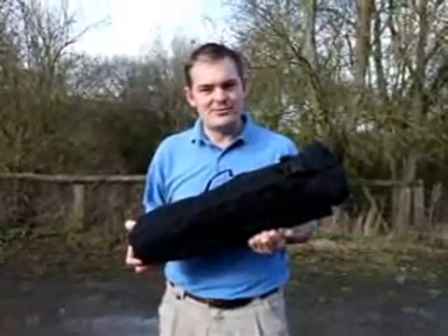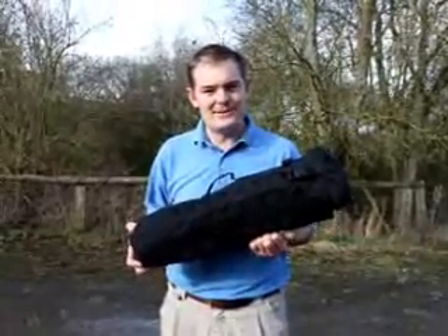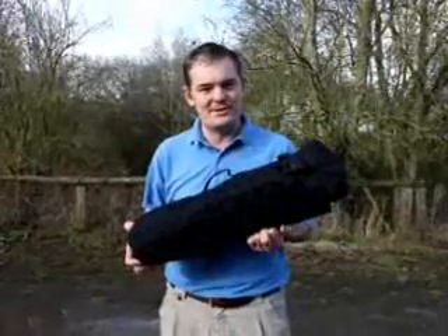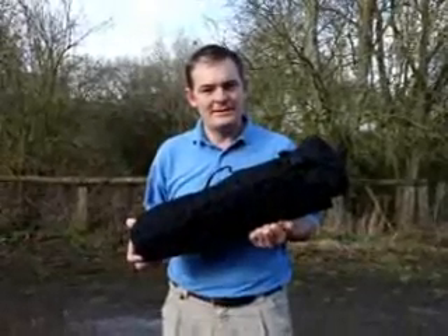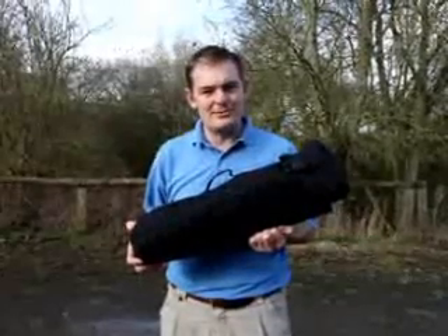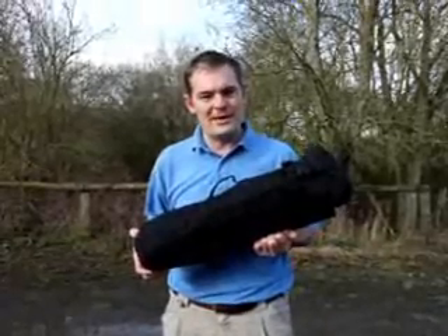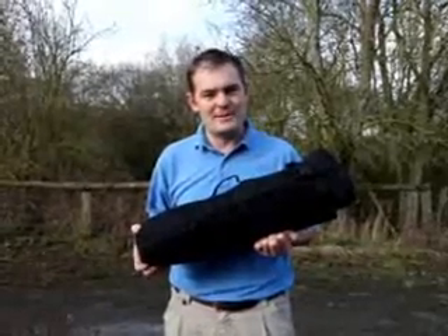This is a Prometheus teammate rescue stretcher. It's designed to be a rapidly deployable, very lightweight stretcher for rescuing someone from a hostile environment. The idea is that the rescuer can approach the casualty, put the casualty onto the device very quickly, and as a single person remove them from the area of threat in a very short space of time.